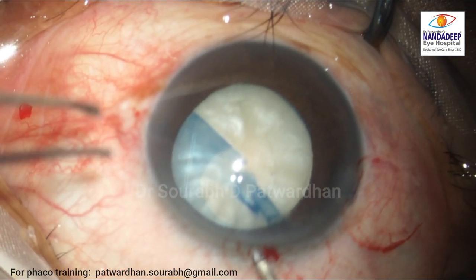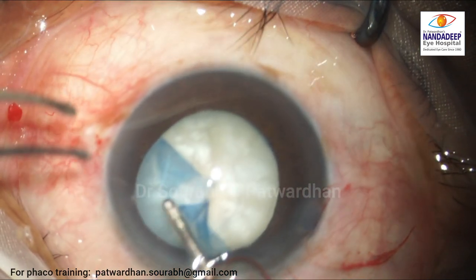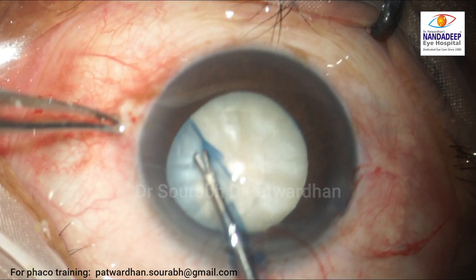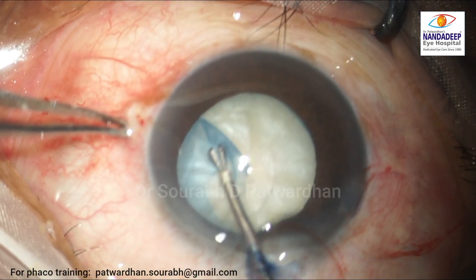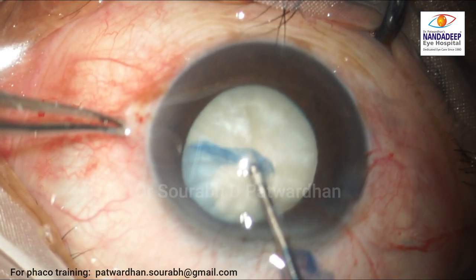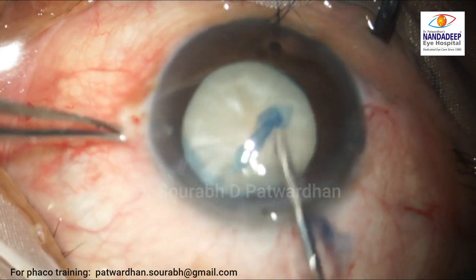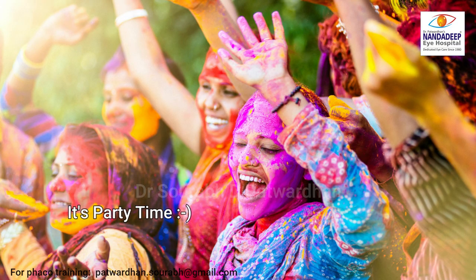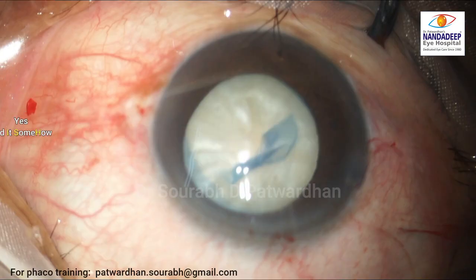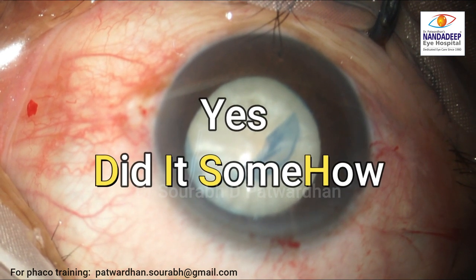The maneuver that should be tried here is a quick pull — pull the rhexis margin centrally as quickly as possible. This is a micro capsulorhexis forceps, and you can see that luckily the capsulorhexis comes back. It's a good result — we have achieved a good, though a bit large, capsulorhexis. Yes, we did it somehow!